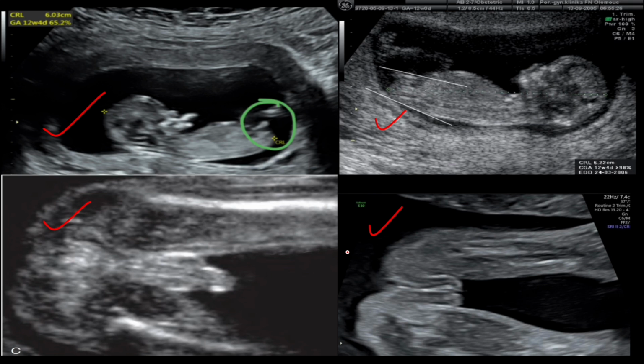In this video, I am going to talk about how to identify fetal gender using ultrasound. By the end of this video, you will be able to determine fetal gender during first, second and third trimester. So without further delay, let's begin.